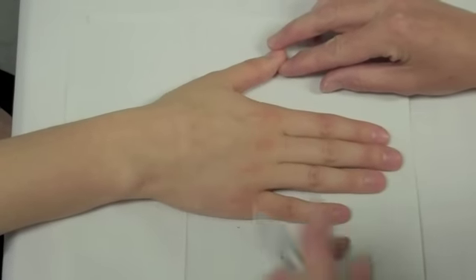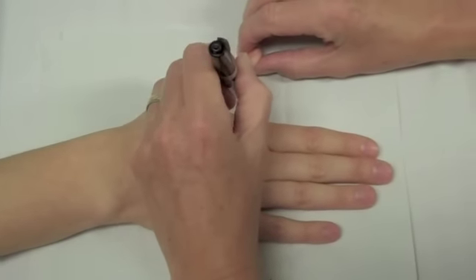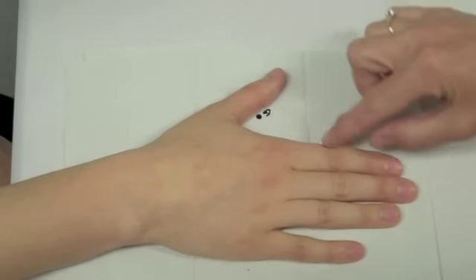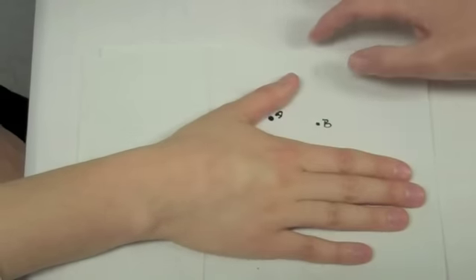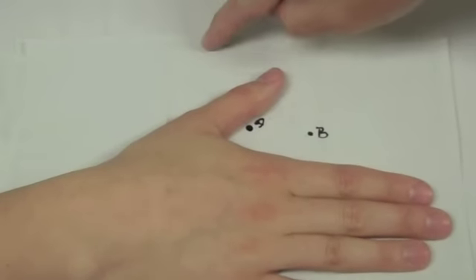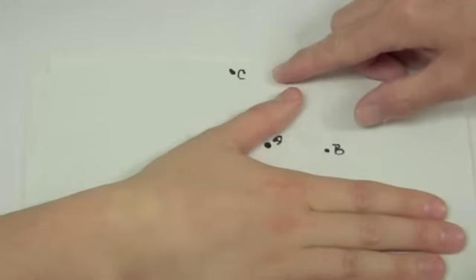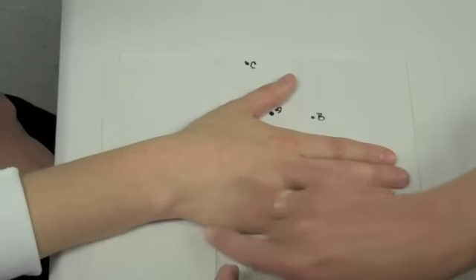Position the patient's hand palm down on a paper towel on a flat surface. Mark an A by the IP joint. At a point equidistant from both the thumb and forefinger, mark a B. At an equidistant spot on the radial side from point B, mark a C. At the radial aspect of the wrist at the CMC joint, mark a D.